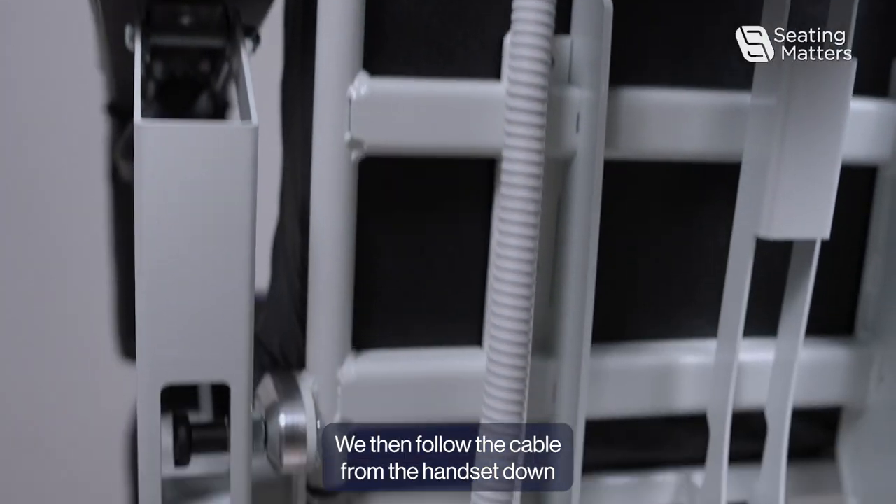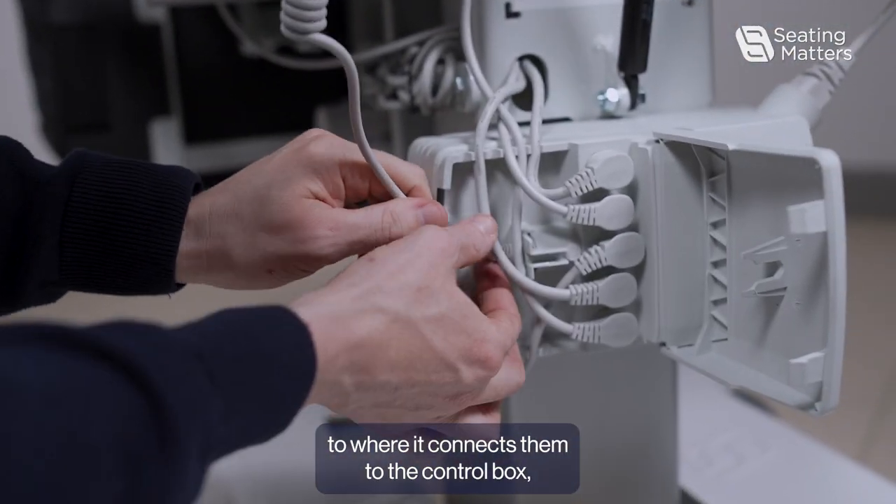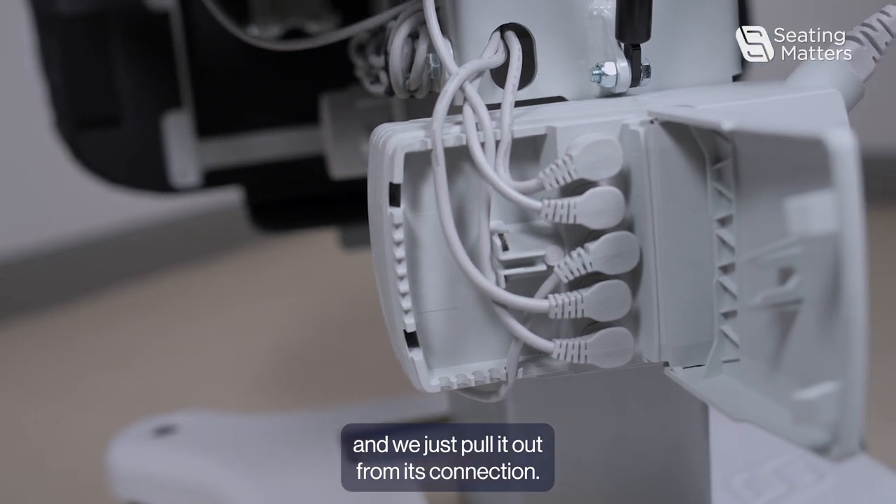We then follow the cable from the handset down to where it connects into the control box and we just pull it out from its connection.